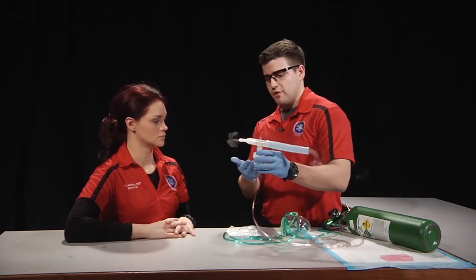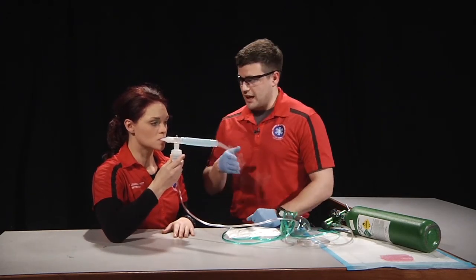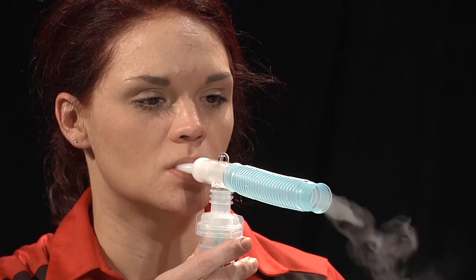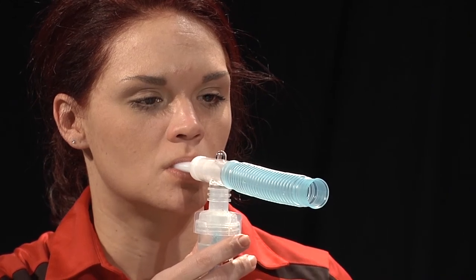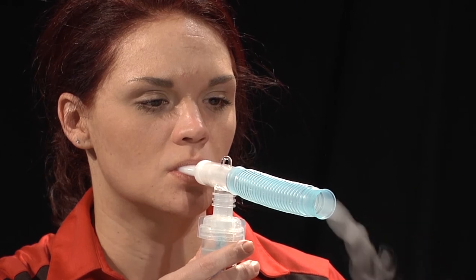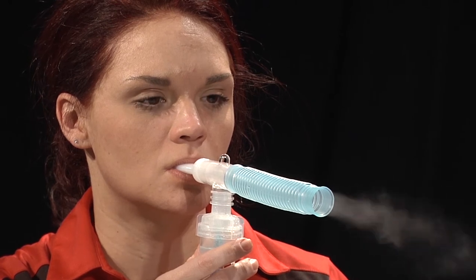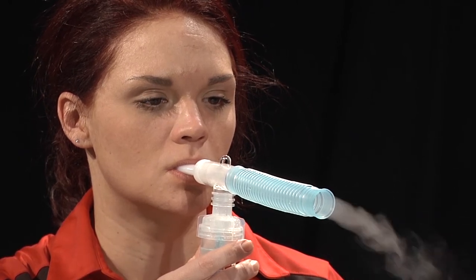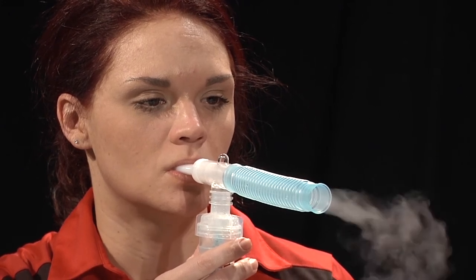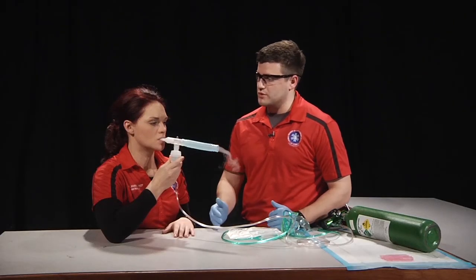Now we're going to coach our patient on how to use the nebulizer. Go ahead and firmly hold this up to your lips. The mist that you're seeing is the medication that we're administering to you. The goal of this medication is to help you breathe better. We want you to inhale for two seconds and exhale afterwards. By inhaling for two seconds, you're allowing the medication to reach the bottom of your lungs, so we're getting the best results from that medication.